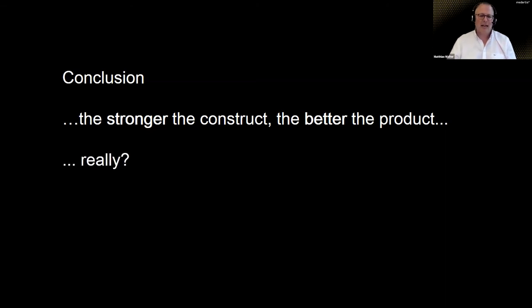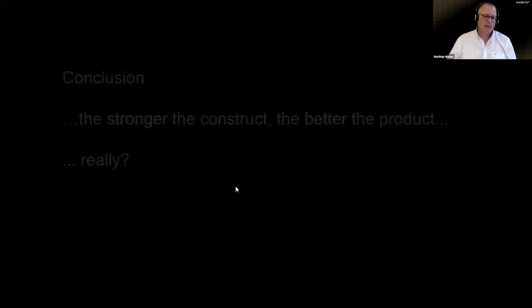And I say, is the stronger construct really the better product? To be honest with you, I don't think so. I don't think this is always the case. High stability is obviously paramount, but we must not confuse ultimate stability with adequate stability. Those are different things. You need to know to which level you want to work, and then we can actually talk about, is the implant strong enough, or is it over-engineered? Is it overly strong? And then certainly it maybe has a negative effect on the overall structure that we try to rebuild.